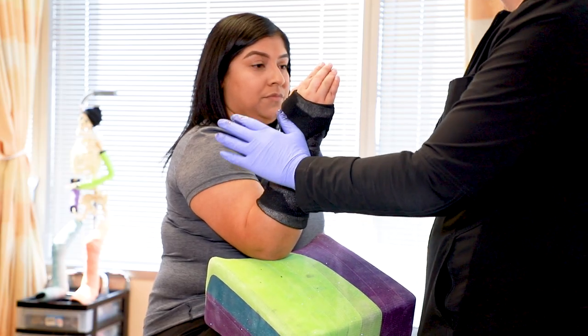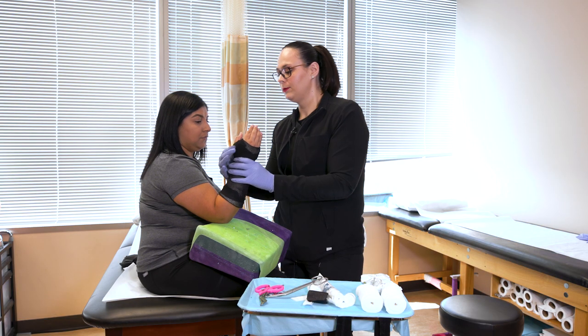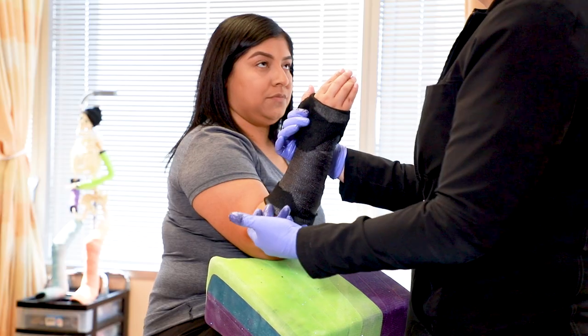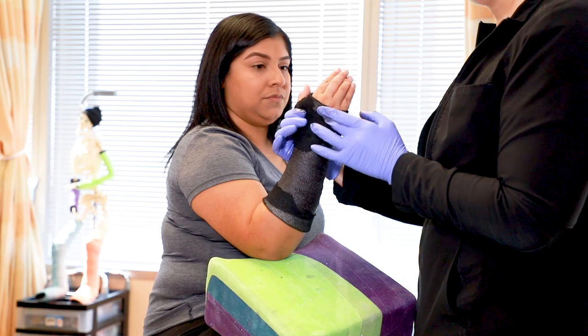In the short arm cast you should still be able to bring your fingers down and be able to move your thumb around. At the ends of the cast we have cast padding to help protect your skin from the edges of the fiberglass.